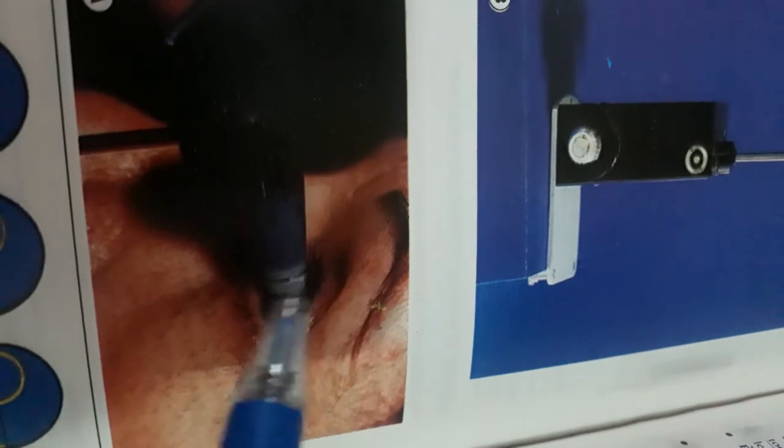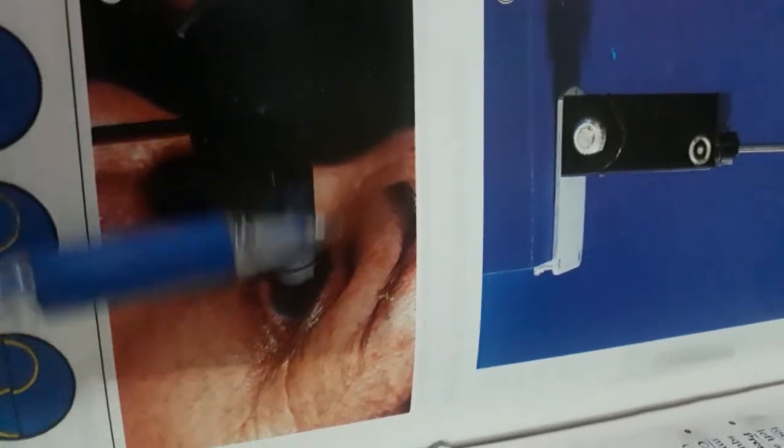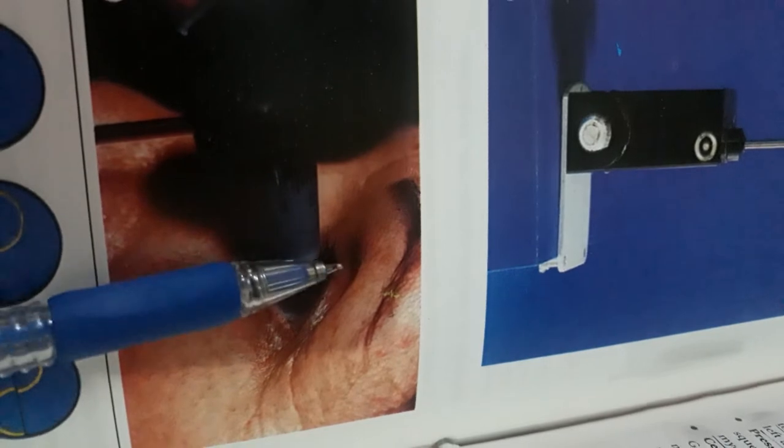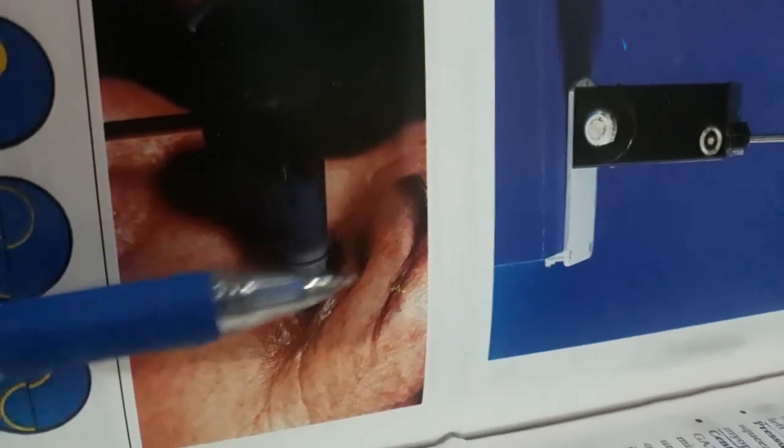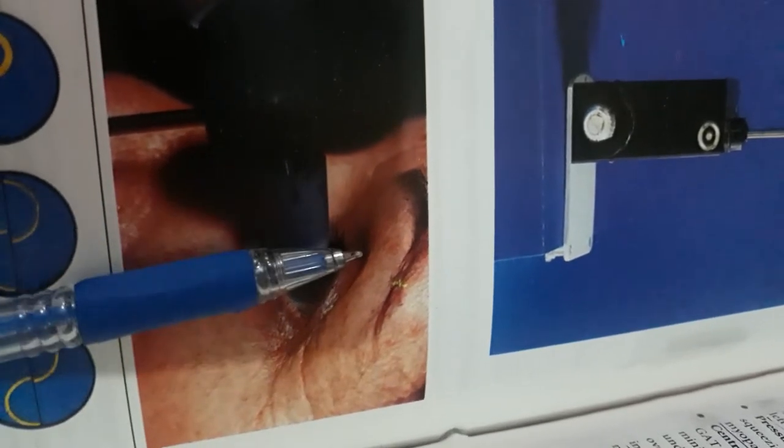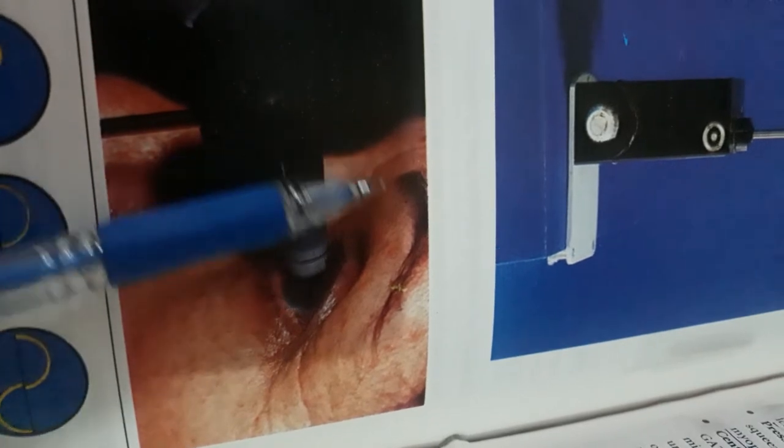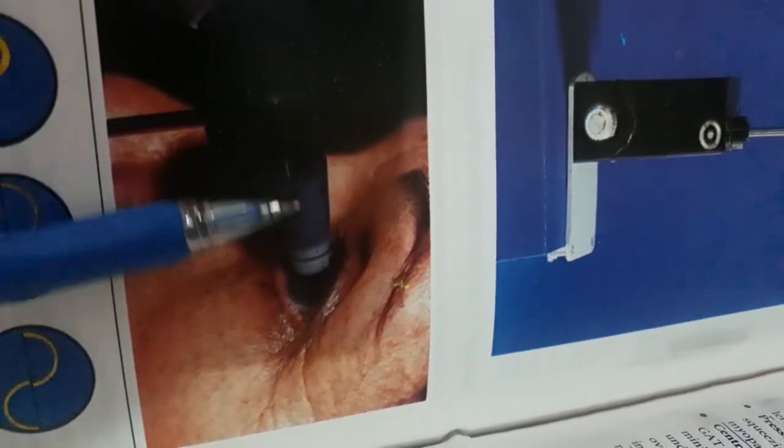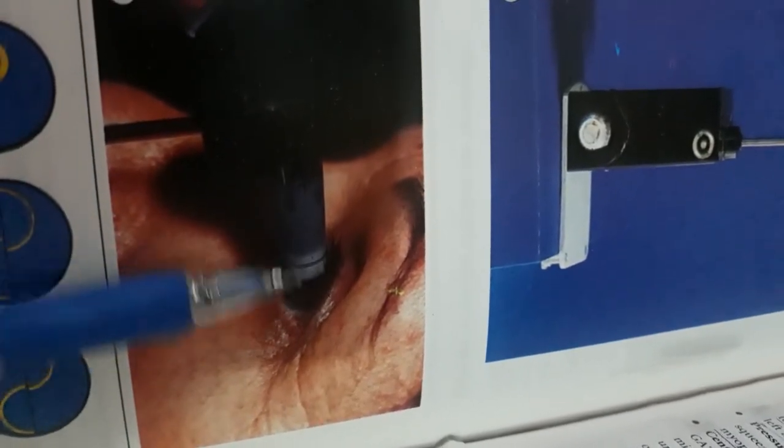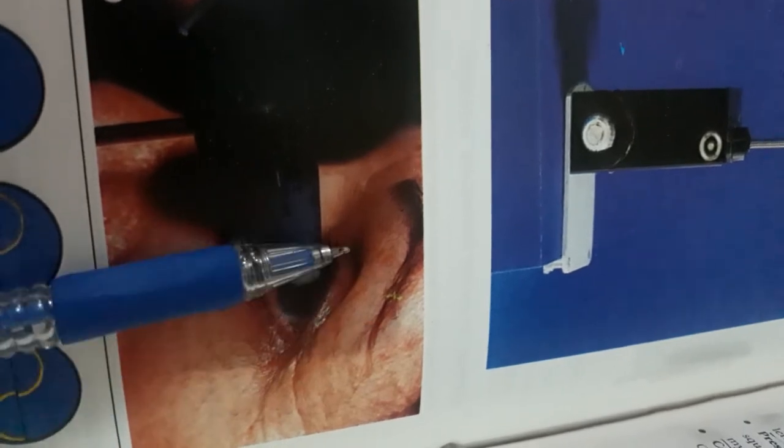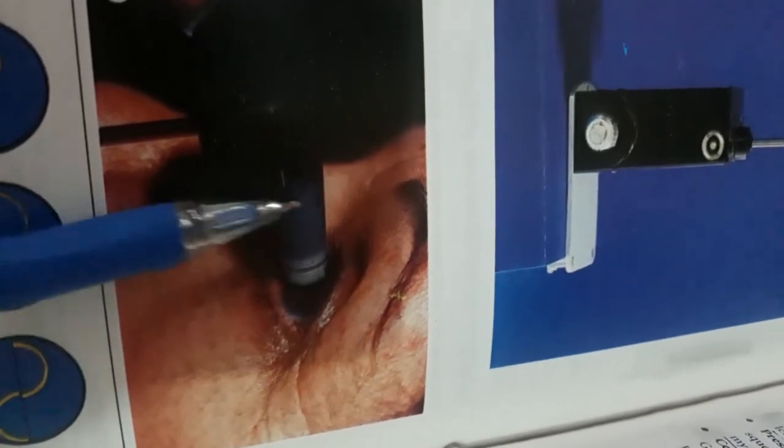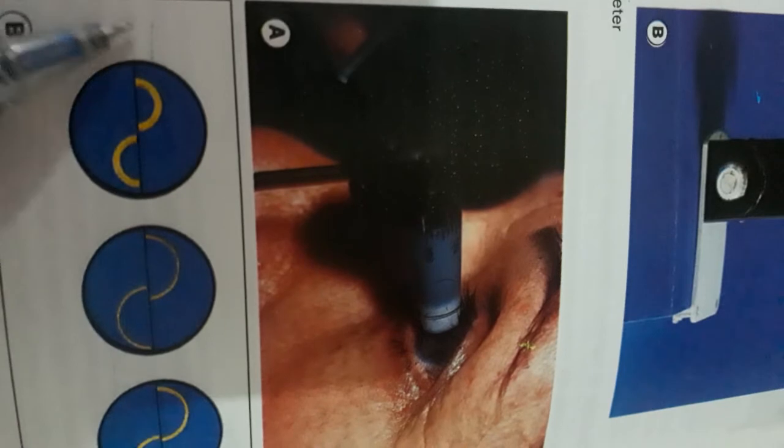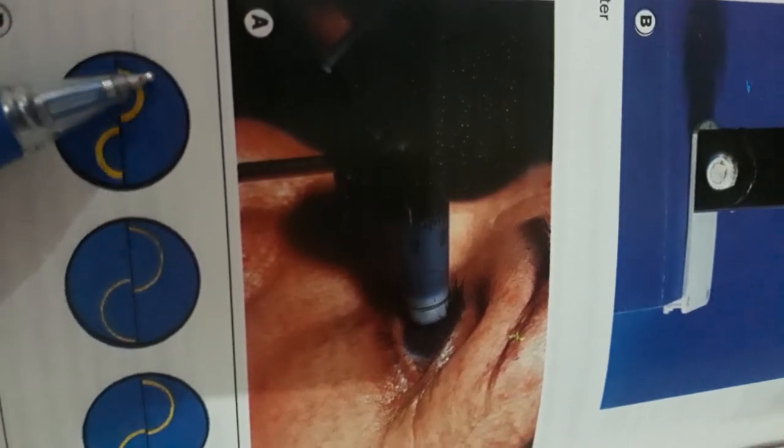The patient is instructed to look straight at the opposite ear of the doctor or ophthalmologist. We use a cobalt blue filter when measuring IOP because mires are formed, so to enhance contrast we use the cobalt blue filter.